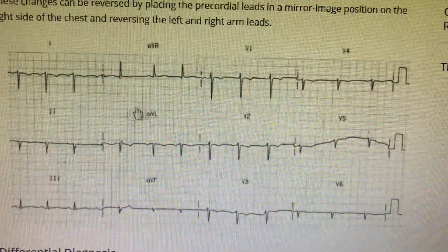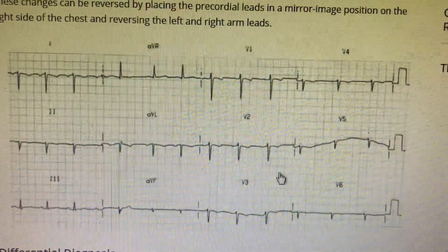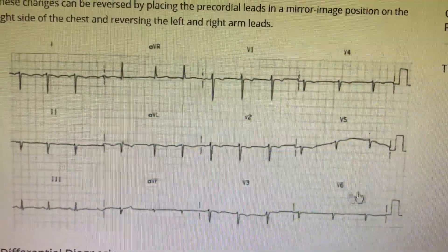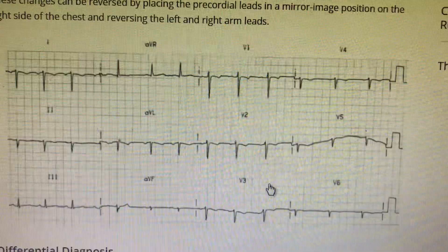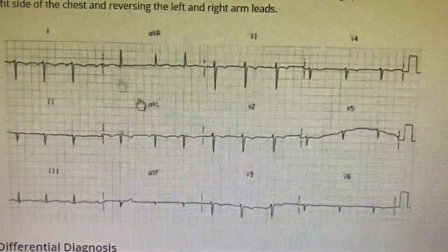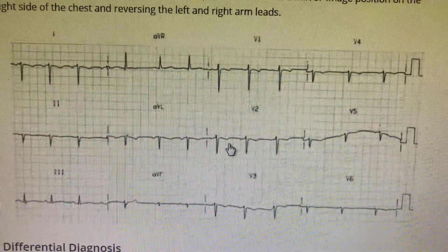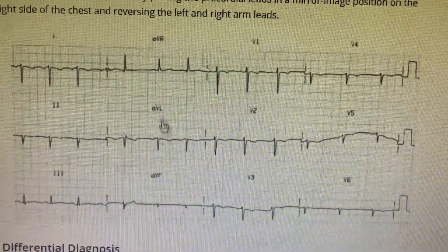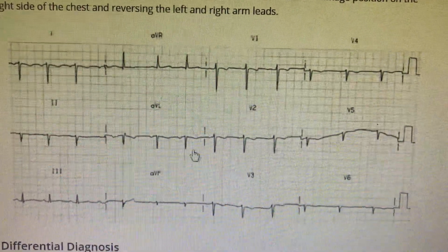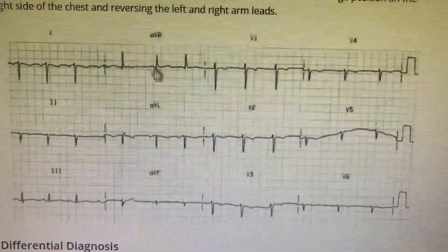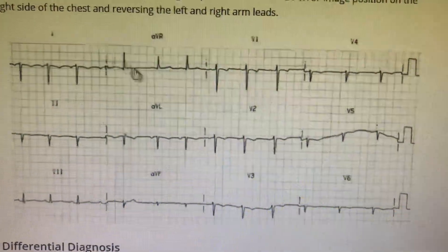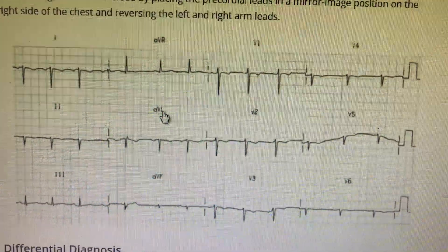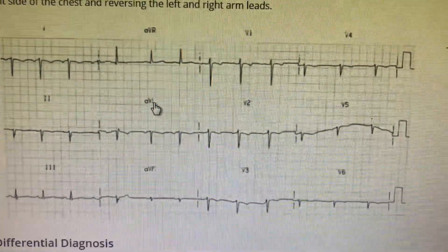Please look carefully at this ECG. The poor progression of the R wave — or the inverse progression of the R wave — is a very important feature to recognize dextrocardia. In dextrocardia, the standard limb leads will look similar to a right-arm left-arm lead misplacement. Thank you.